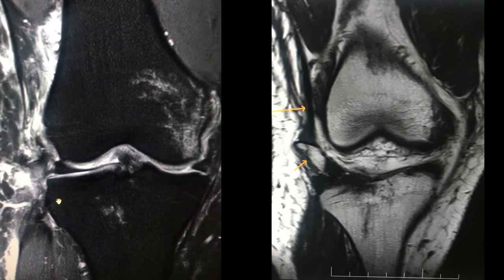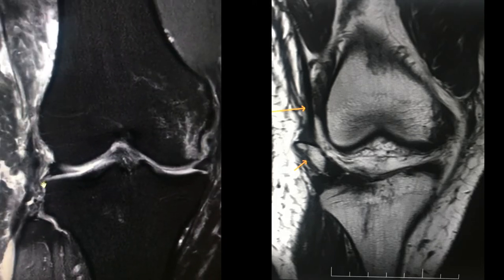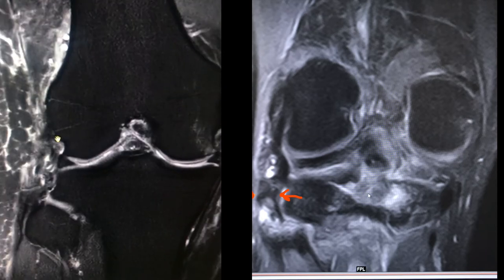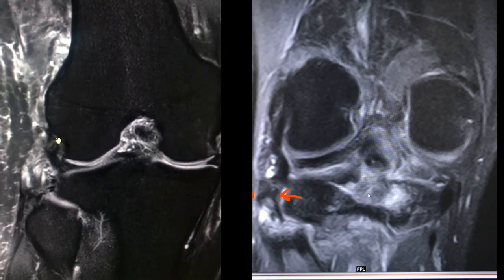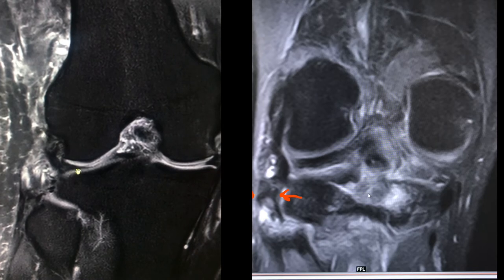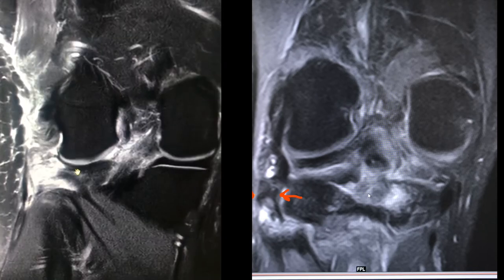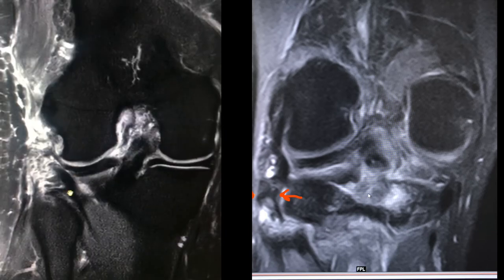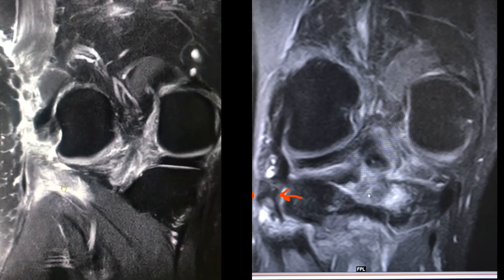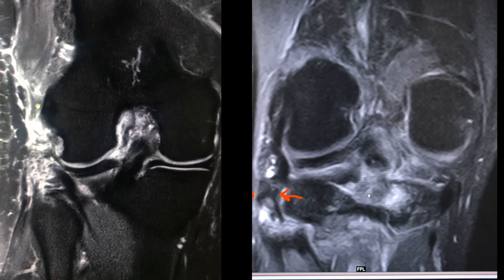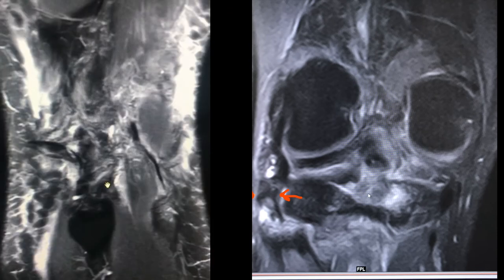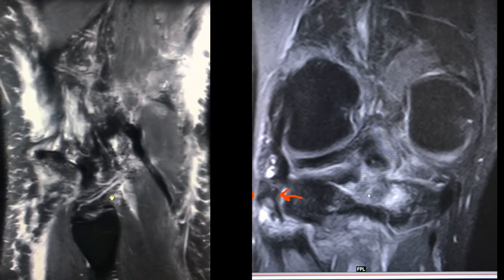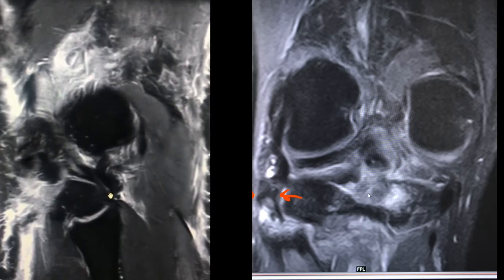Behind this, there is the lateral collateral ligament, which is wavy, and there is a tear from the femoral attachment. You can appreciate the increased signal in the attachment of the popliteus tendon, but the tendon is not torn. The popliteofibular ligament is partially torn, with increased signal also seen at the lateral collateral ligament as well as the biceps femoris tendon.